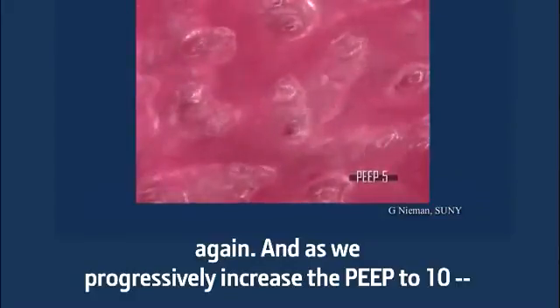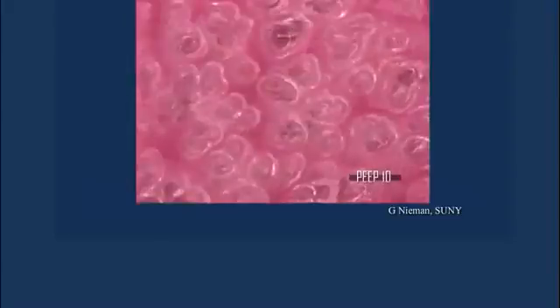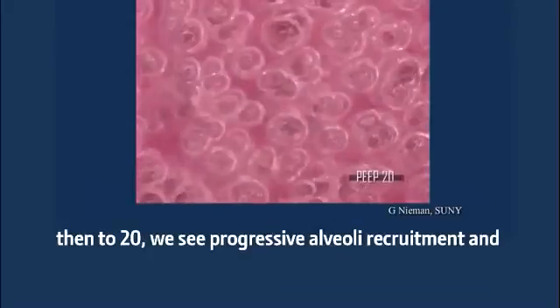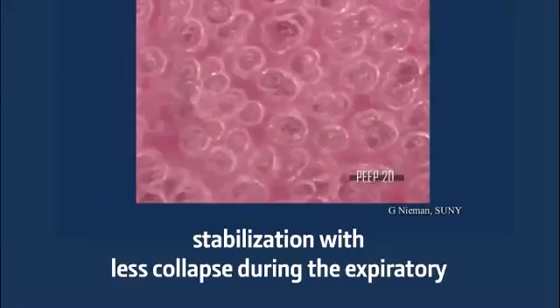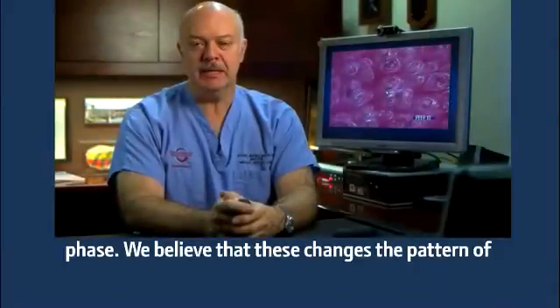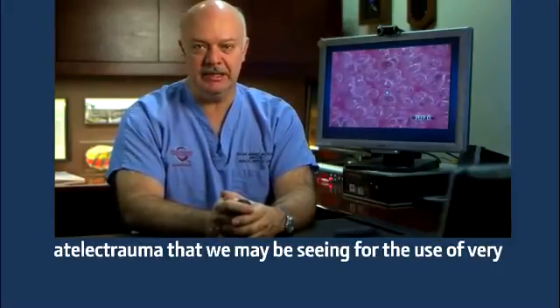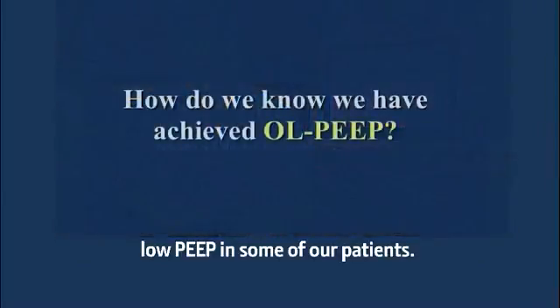And as we progressively increase the PEEP to 10 and to 15 and to 20, we see progressive alveolar recruitment and stabilization with less collapse during the expiratory phase. We believe that this changes the pattern of atelectrauma that we may be seeing with the use of very low PEEP in some of our patients.